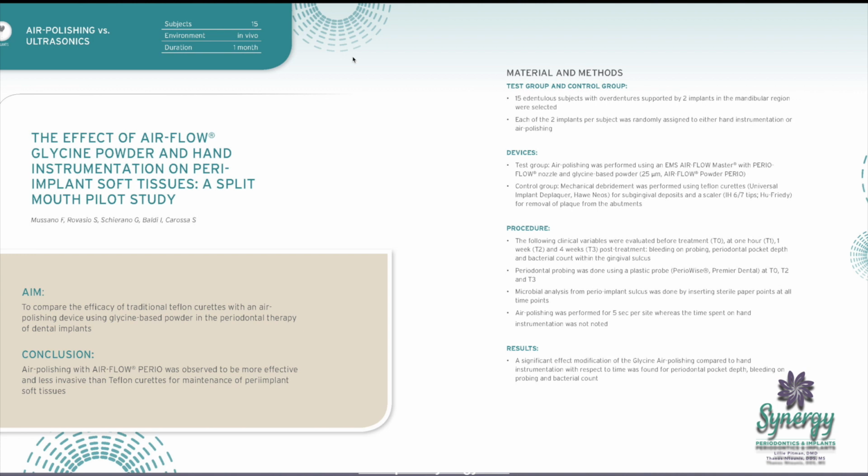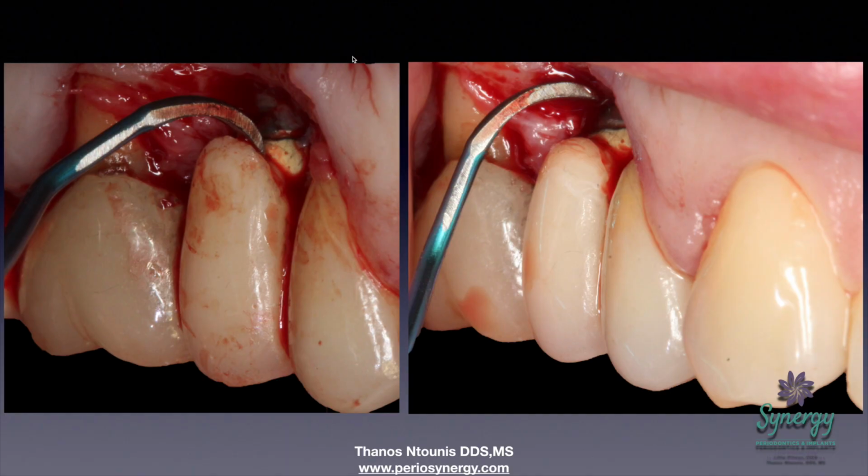After all that is done, ideally as a step immediately after the reshaping, this is the reshaping that has taken place on that particular situation. So with a high speed and a diamond burr, we literally just remove the ledge from the crown. We provide a better environment for that patient to clean. And you can see how this has been altered. One could have been even more aggressive in this particular situation. Of course, polishing of this area needs to take place afterwards.